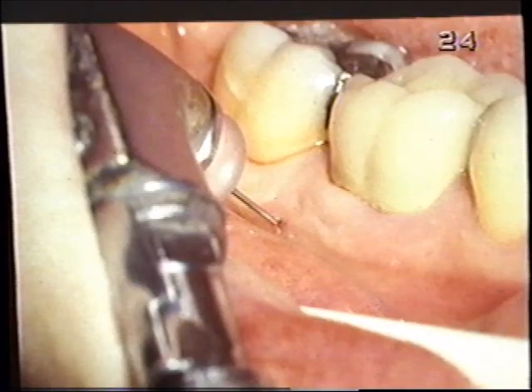And you'll feel that. It'll lunge somewhat, and you'll know that you're into the trabecular area. You're into the cancellous bone between those two roots. Eyeball it in such a way that you miss the roots, but you get it in between the roots.